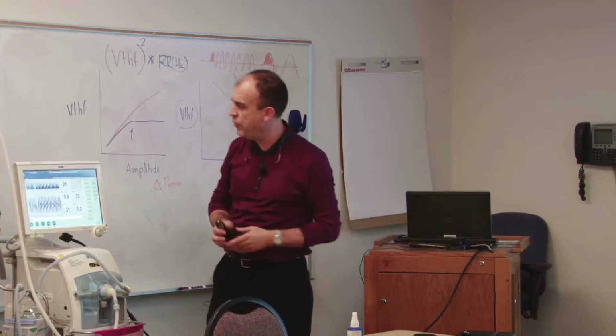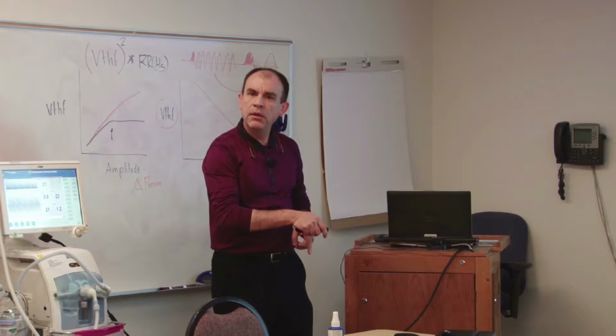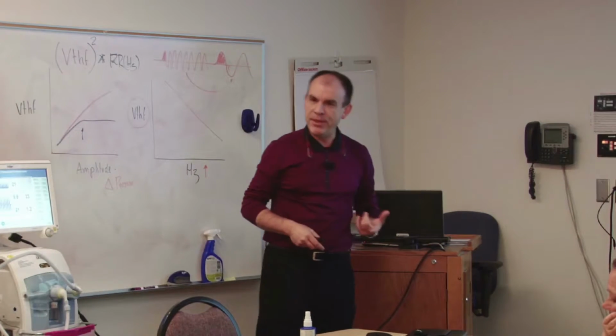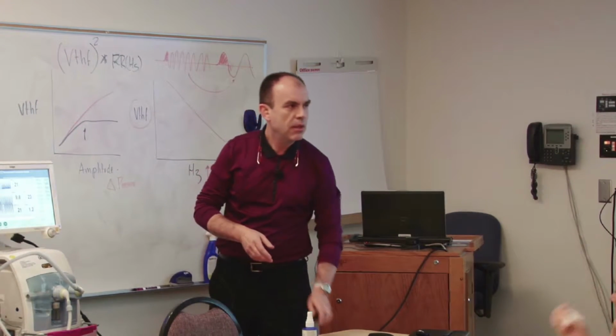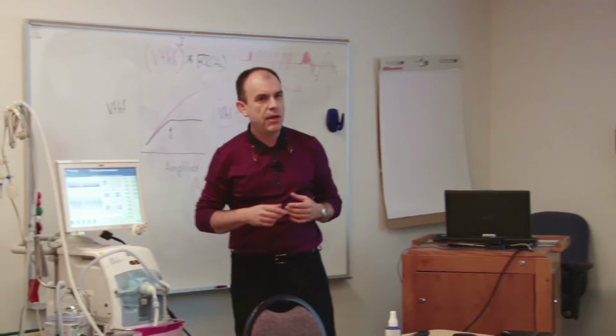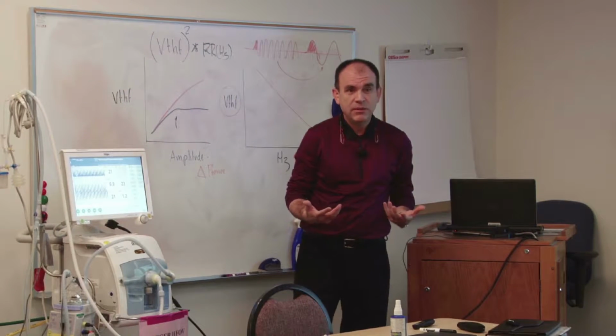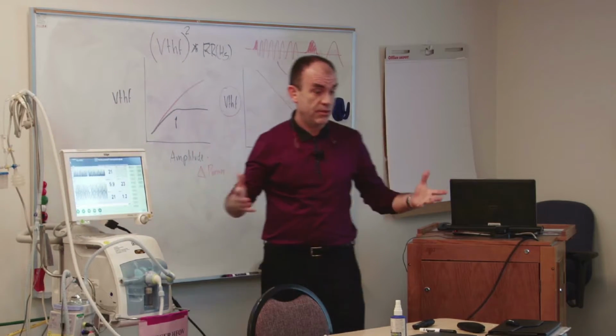And I can assure you of that, because we can dial whatever we want here, but nothing's really happening. And that's because the ventilator is maxed out.